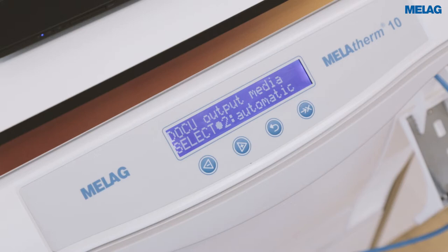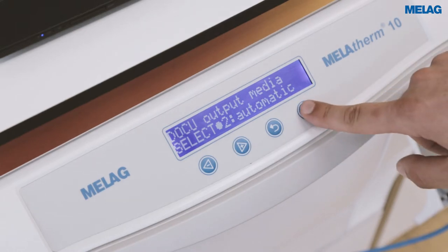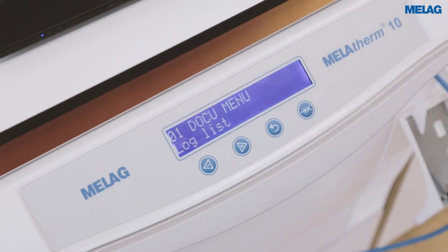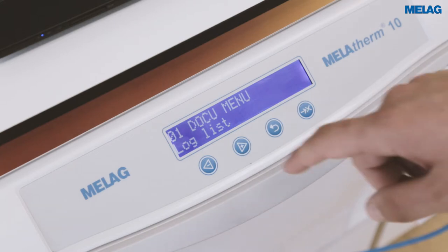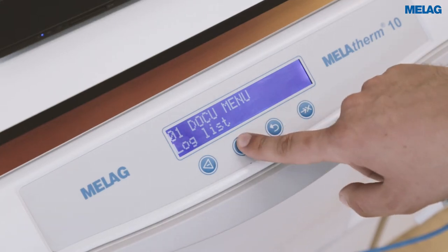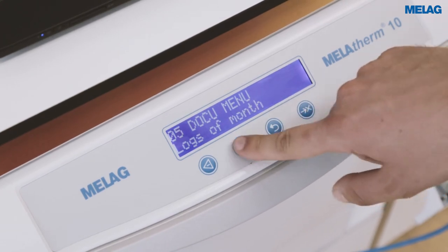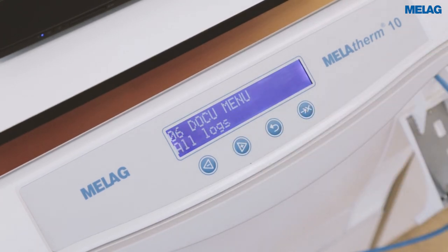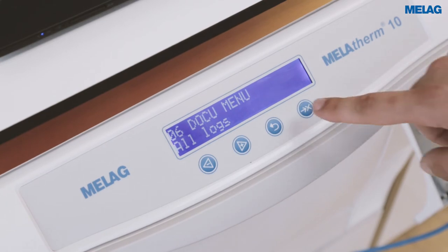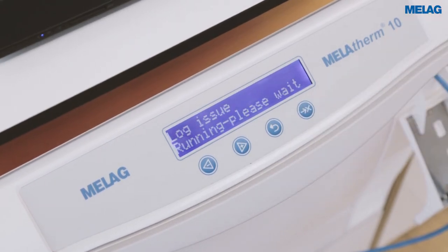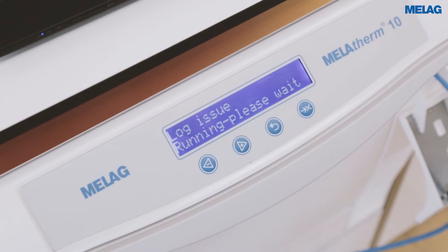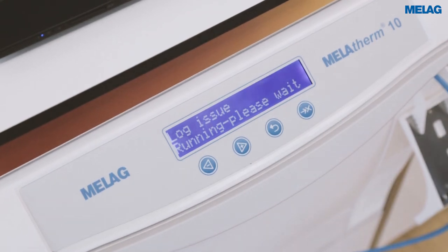Now you will be asked for the output media. You can confirm it with the fourth button to the right side and leave it on automatic. Now you need to go to the sixth menu of the docu menu, which is called all logs, by using the plus button numerous times. If you see 'log issue running' please wait, and if you do not get an error message, that means the transfer is successful.